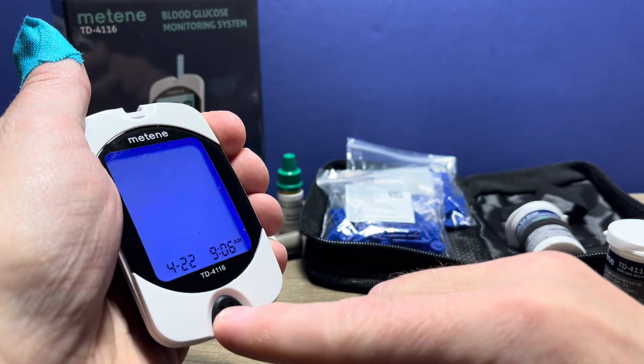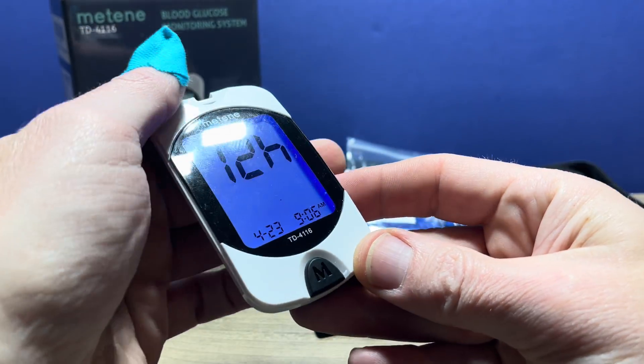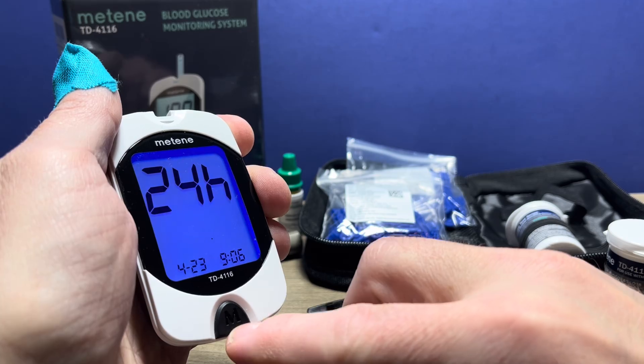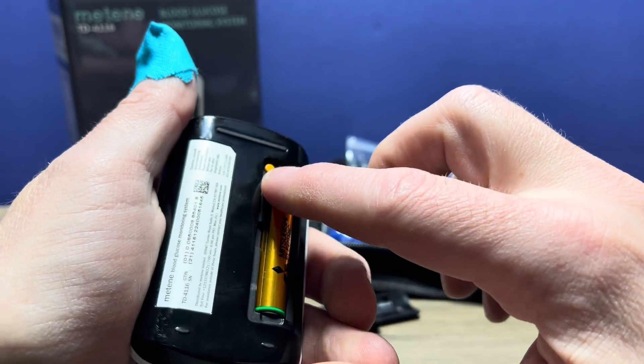Then we're on to the date — same process. Press the M button until it's the correct date, then press the set button. Now we're on to whether you want 12-hour or 24-hour time — a.m. and p.m. or what some people call military time. Put it to your desired setting and press the set button.